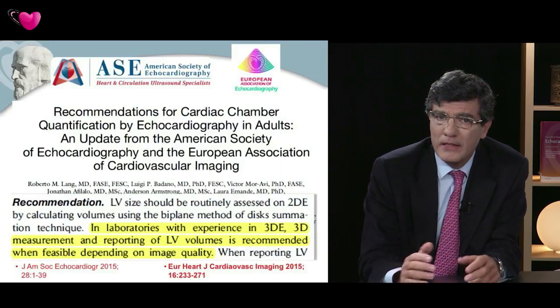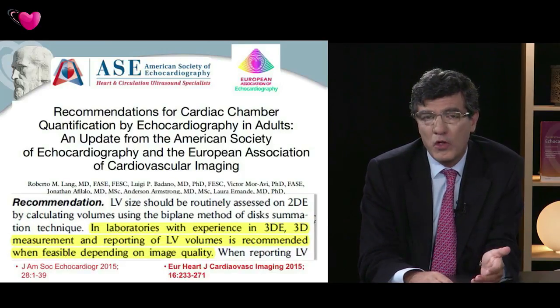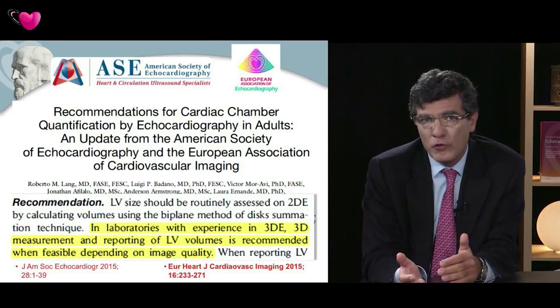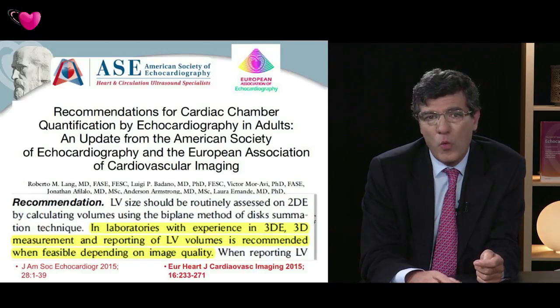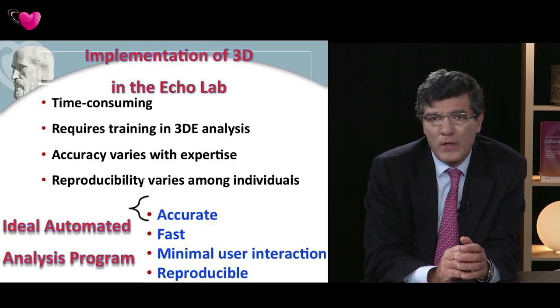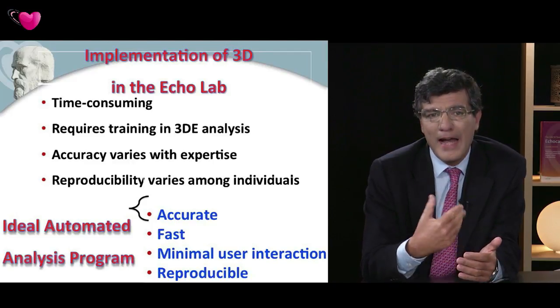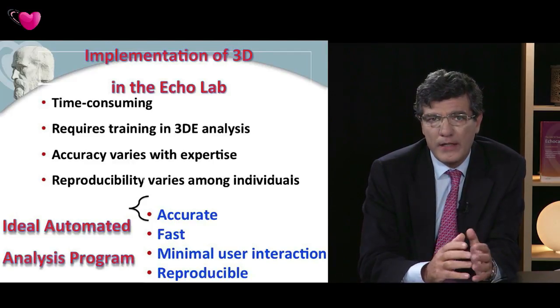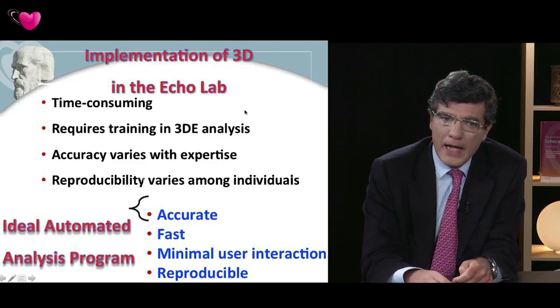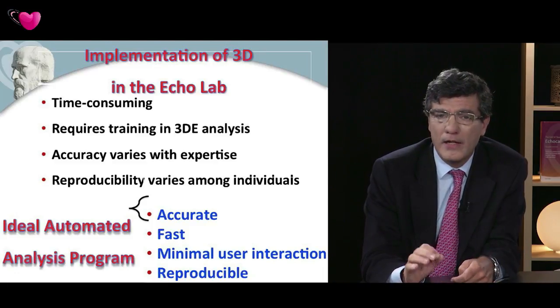And this is why the current guidelines suggest to use 3D, but to know is not to do. We know that 3D is superior, but it is not used in many laboratories. So what is the ideal answer to this question? Well, the ideal method we know is 3D, but what we want is also to have an automated way of quantifying things while doing echocardiography. In fact, what we need is an accurate system, fast, easy to use, with minimal user interaction and reproducible.